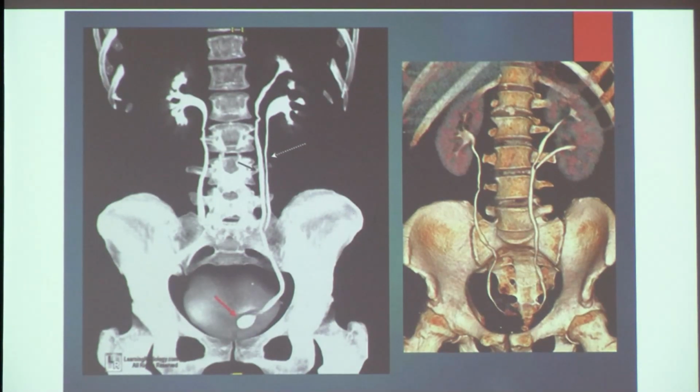So what is exactly a ureterocele? Basically it is because of the weakening of that particular area, so that there is dilatation of the whole mucosa, and ultimately it gives rise to a cystic dilatation of the lower end of the ureter, something which is known as a ureterocele. We will be having a look at the ureterocele in the later films.